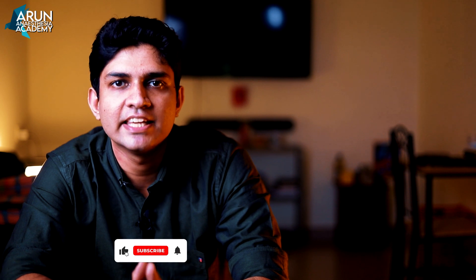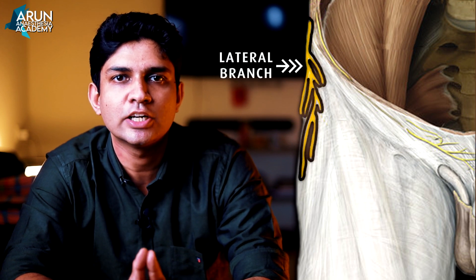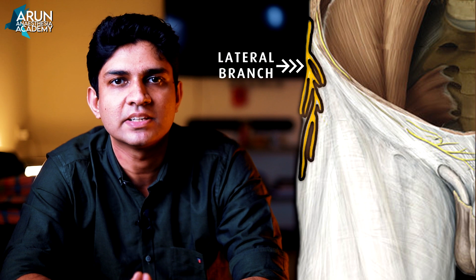To summarize: the ilioinguinal nerve is deep to the transverse abdominis posteriorly, then lies between the transverse abdominis and internal oblique more laterally and anteriorly, and medial to the anterior superior iliac spine it lies within the inguinal canal and exits through the superficial inguinal ring.